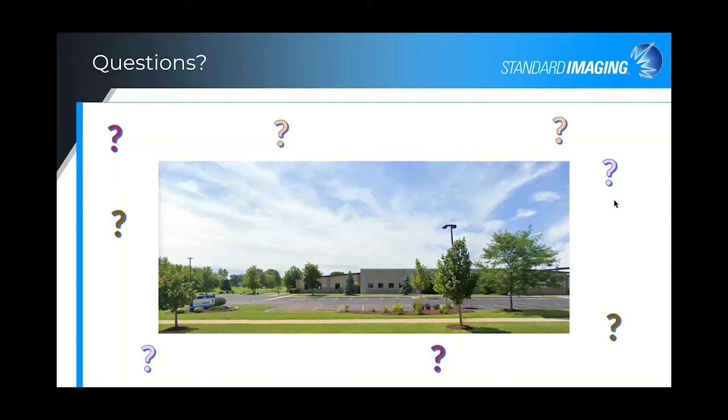So you will see the cumulative measurement, the measured versus predicted, for the cumulative as well as each arc for VMAT. We have discussed different options, like looking at a more granular detail, but at this point in time, it is arc-based. The next question, is it available for tomotherapy? Not at this time.